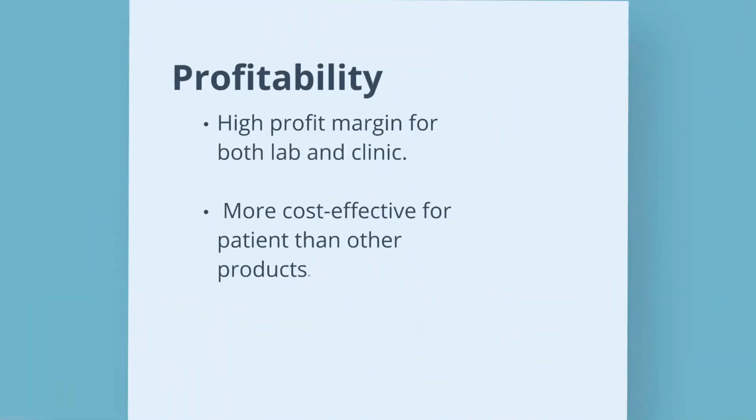The biggest thing is your bottom line. Clear aligners can be highly profitable for both labs and clinics. By doing these in-house, you can offer patients a very good product, basically the same thing as Invisalign, at a much better price.